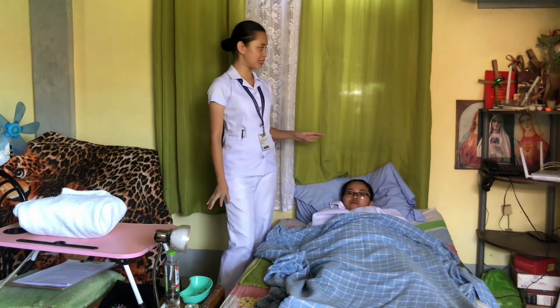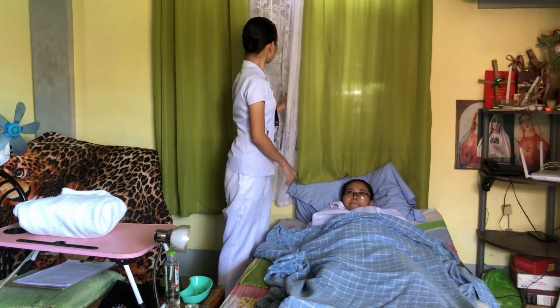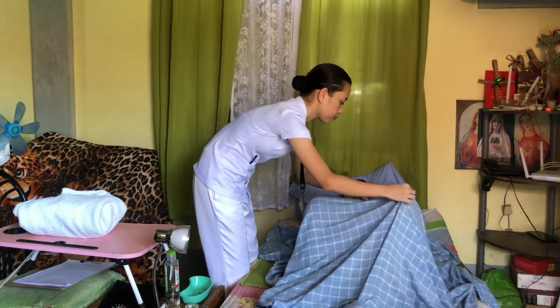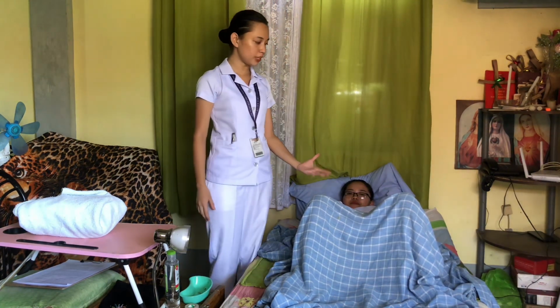Okay, thank you. So before we begin, we need to provide privacy by screening or closing the door and position the patient on the dorsal recumbent with the knees flexed. Okay. So, ma'am, can you flex your knees? Okay, so this procedure ensures that the patient is comfortable and has a good visualization of the meatus, which is essential to introduce the catheter. Also, gravity will aid the flow of the urine when the bladder is higher than the end of the catheter.